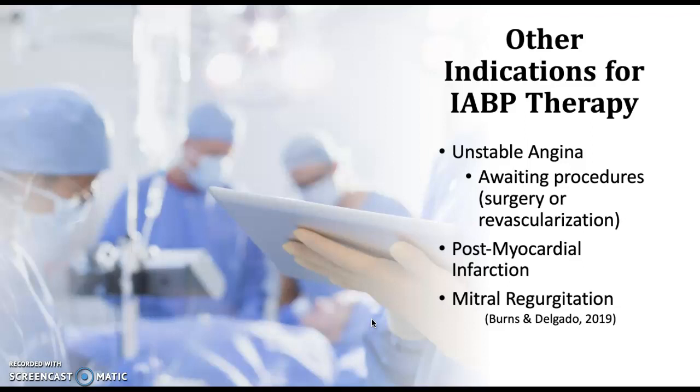Another indication is for a patient who's had a myocardial infarction, and because of that, the balloon pump can be used here as a preventative measure for persistent ischemia and reinfarction. And lastly, somebody who's had a heart attack may develop mitral regurgitation after the fact, and this type of balloon therapy can actually help to decrease afterload and help to diminish the regurgitant blood flow.